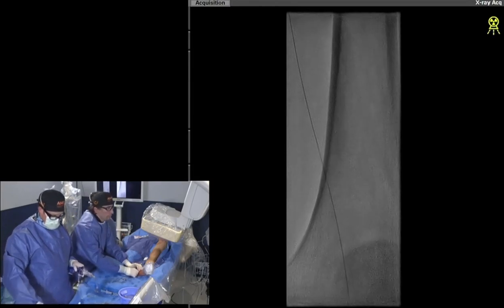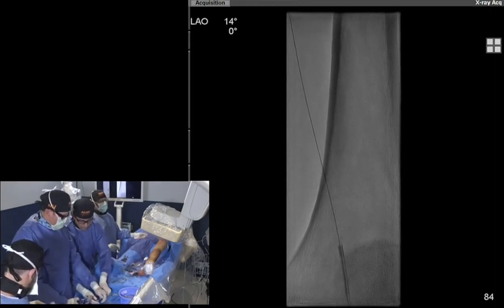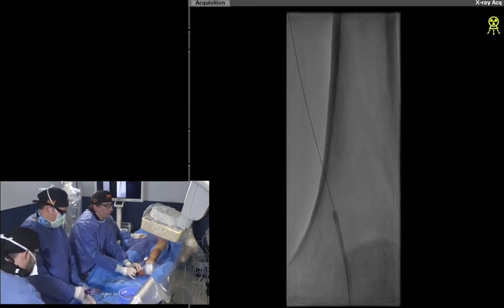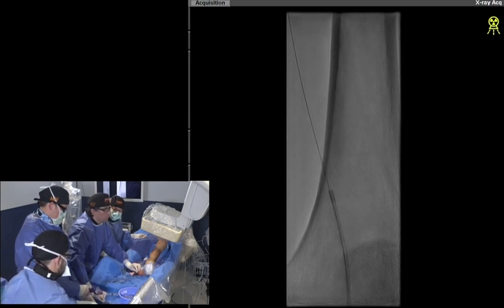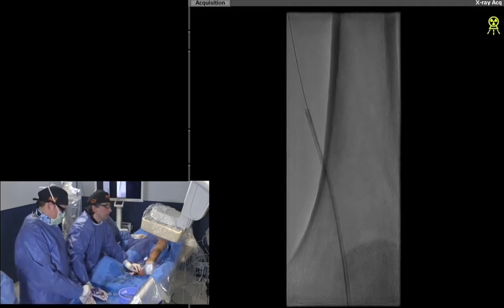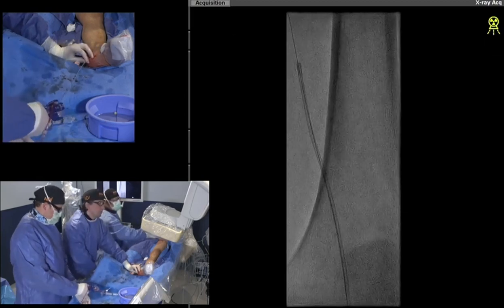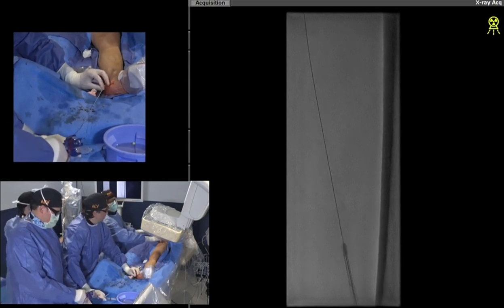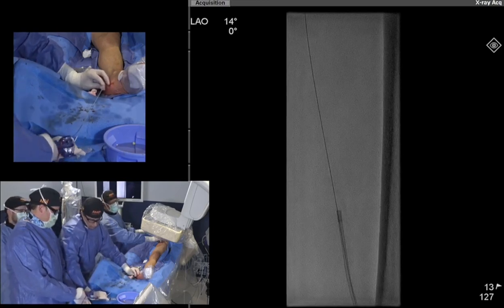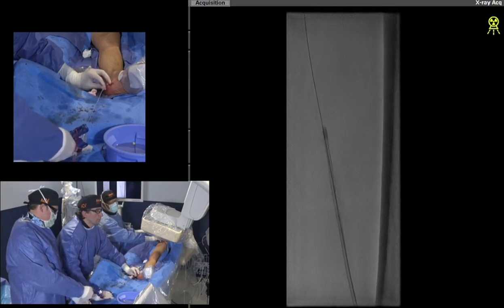Faddy showed the characteristic of the plaque on IVUS — chronic total occlusions have soft plaque in them. I usually balloon or use atherectomy first and then take out the soft plaque with mechanical thrombectomy. We're aspirating right now — the multipurpose catheter is being rotated as it aspirates. We have a floss through the antegrade sheath so I can move all my equipment easily. Dr. Bernstein is giving tension on the wire as we retain the multipurpose catheter during aspiration.